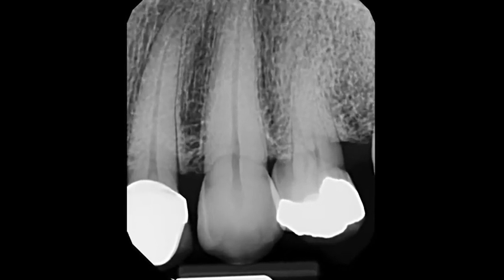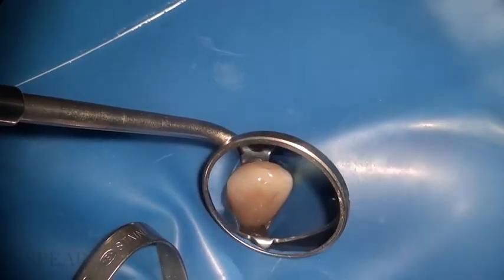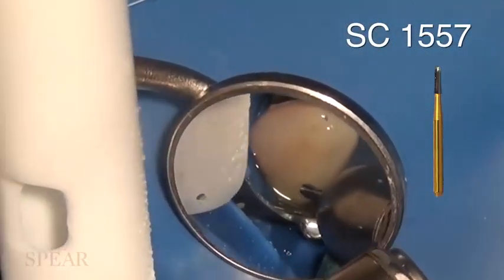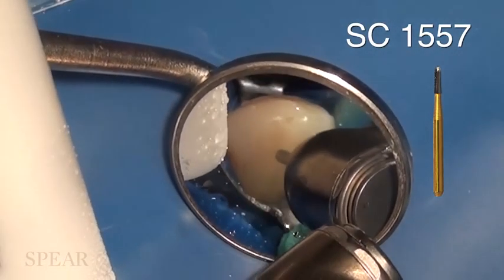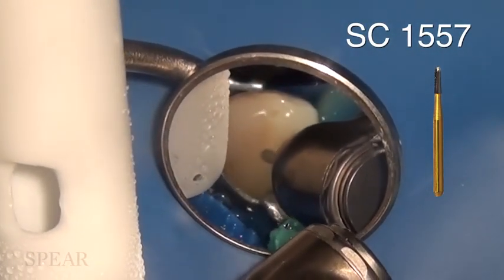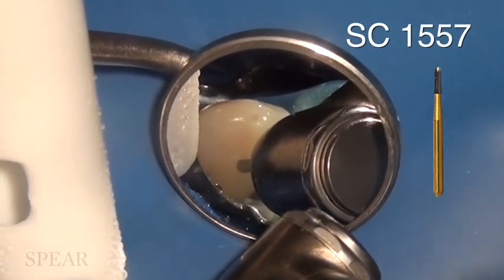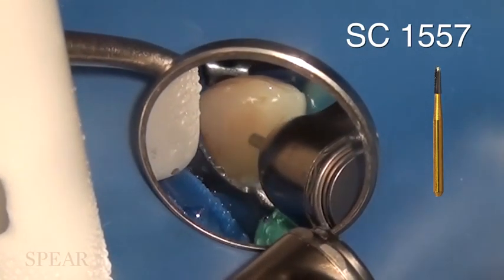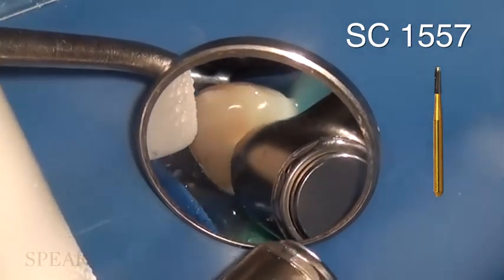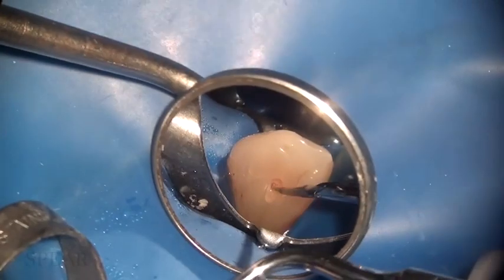The diagnosis was necrotic. It just recently became necrotic after a bout of toothache. So the first burr I use on this is the saber cut, the 1557. Again, being an anterior tooth, I'd like to use the 57 versus the 58. Now, the key here, when you go through virgin enamel, is you don't want to just go in there and press hard. You create a ton of craze lines. You need to really gently brush back and forth, using lots of water, so that you preserve the integrity of the enamel.